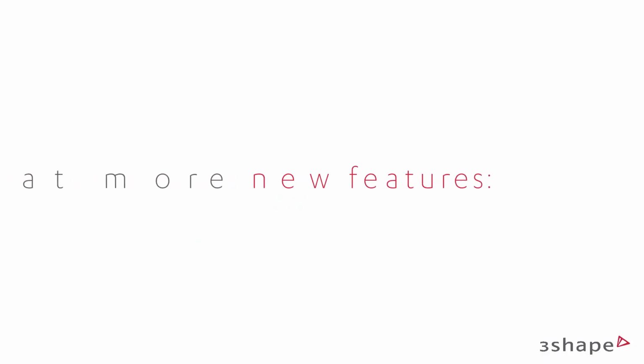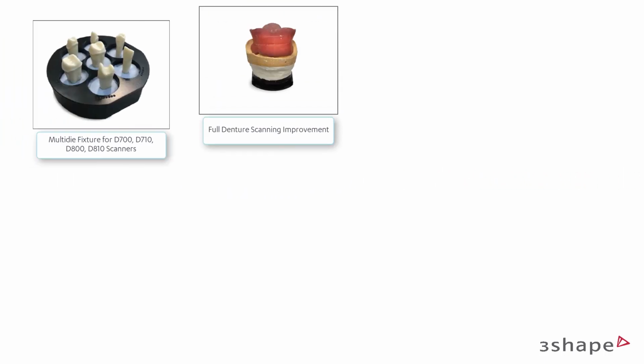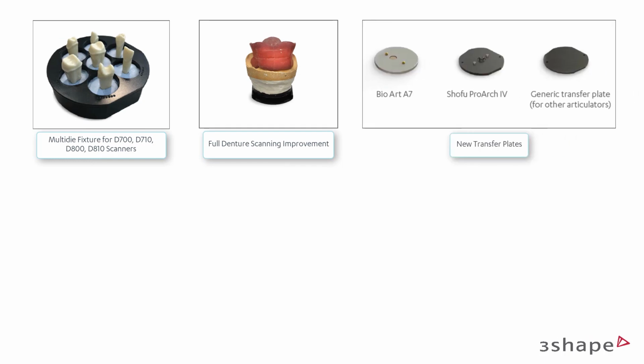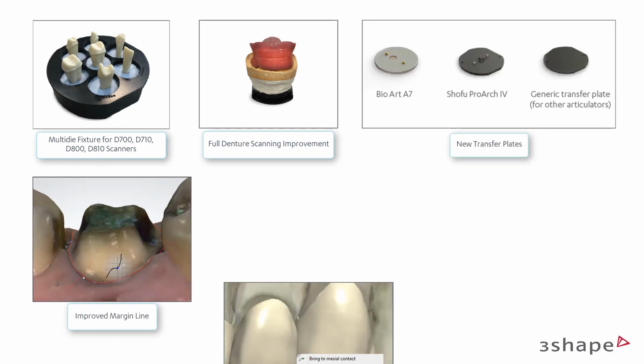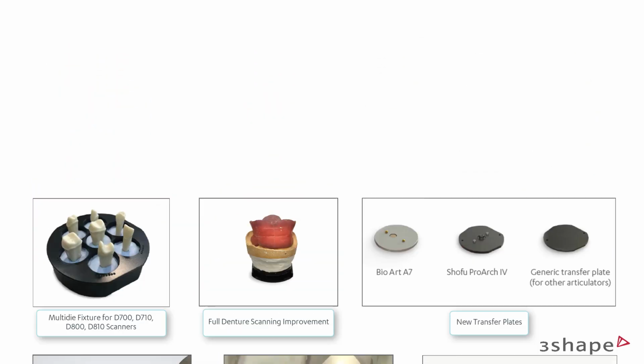And here are a few more of the many new features coming in Dental System 2018. Multi-die fixture, full denture scanning improvement, new transfer plates, improved margin line, bring to contact tool, stronger contact smoothing tool. New tools for scan adjustment.